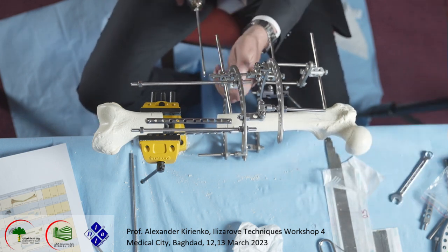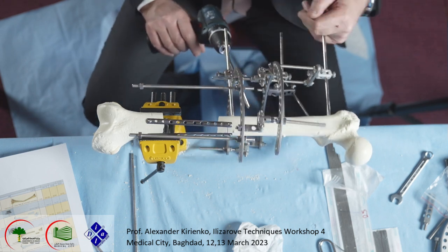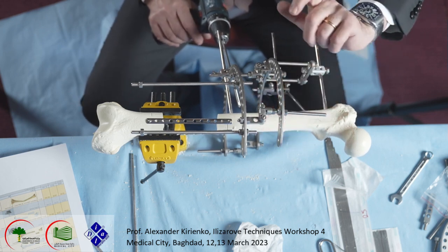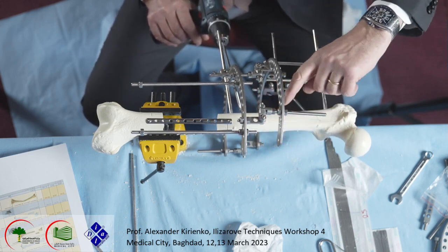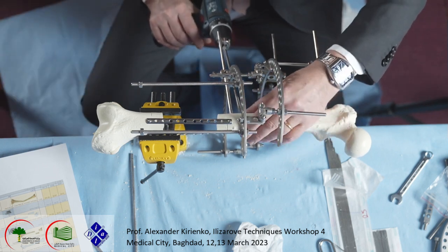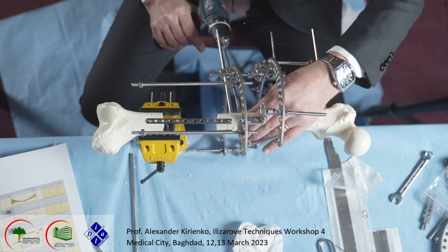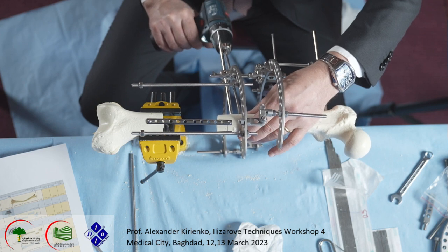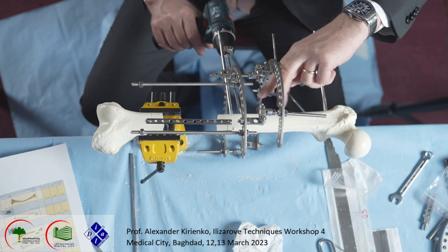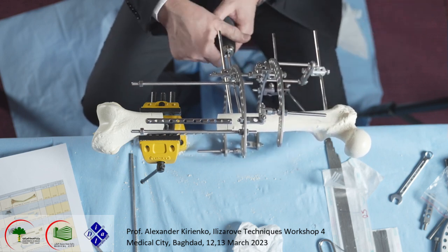I put this. Okay, when you put this half pin, you should create a reserve of skin between this half pin and this half pin. Tension the skin, so that when you do lengthening, you have a reserve of skin. It's never enough, but always try to do this. Put this tension of the skin before putting the half pin.